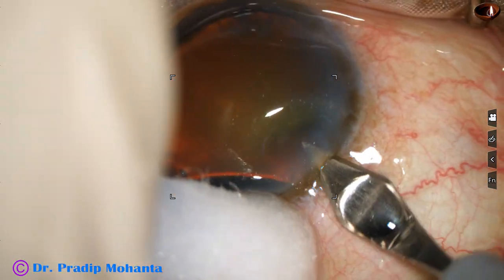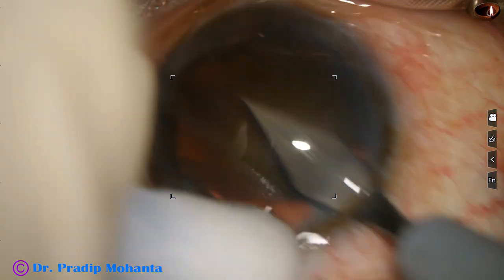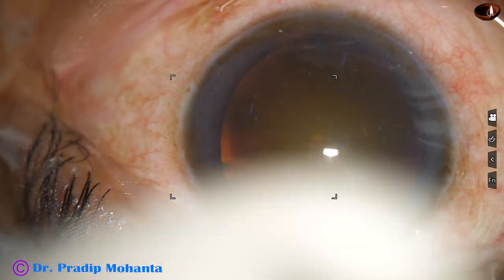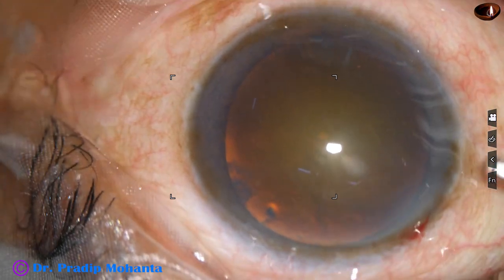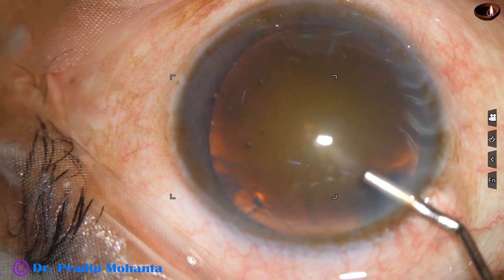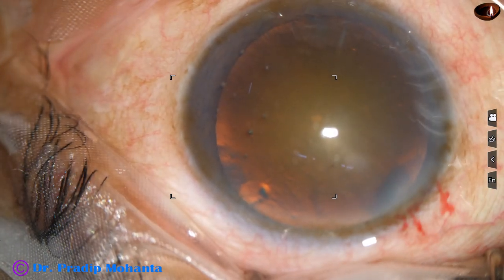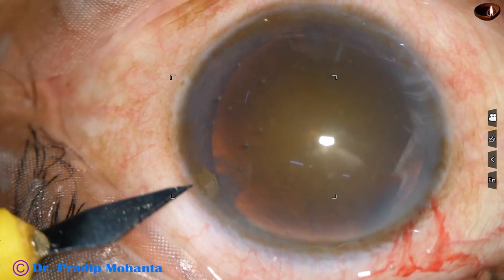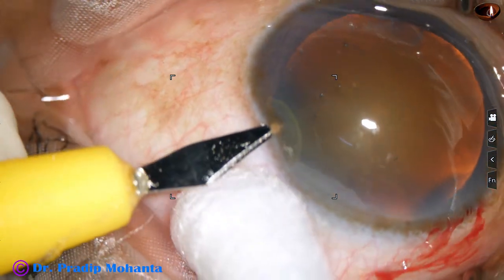This is the main incision with a 2.8 millimeter steel keratome, and now the anterior chamber is filled up with 2% hydroxypropyl methyl cellulose. Then a side port is made on the left side of the main incision.